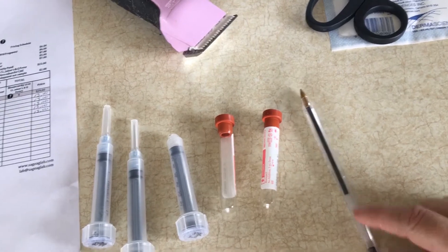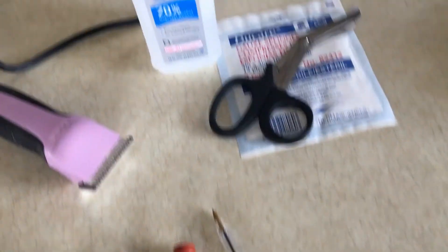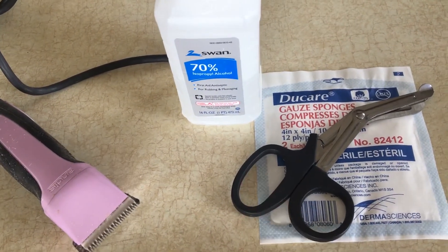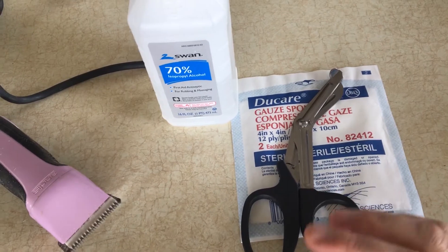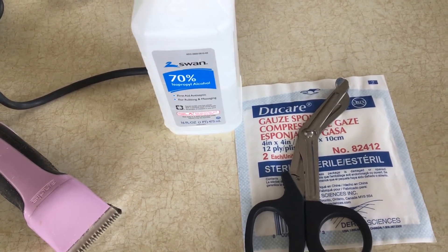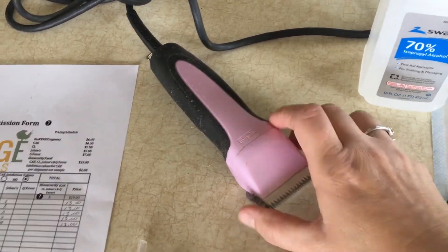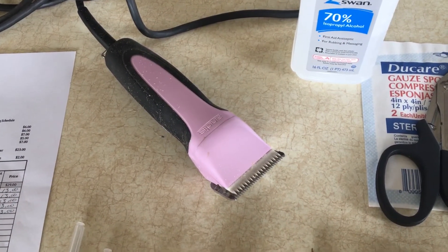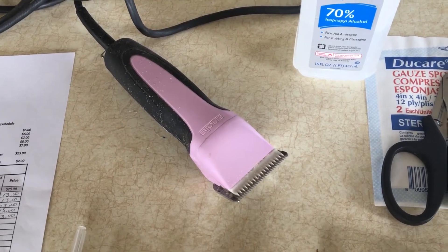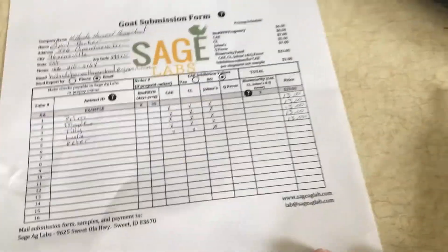I get the vials from my local vet. You need some sort of marker — I use a pen to put the animal's name or identification on the vial. I do like to use rubbing alcohol to clean the area beforehand. You can apply it with gauze. You should disinfect the area as best as possible — it also helps wet the hair down so you can see the vein more clearly. I use trimmers to clip the neck area where I'm going to be drawing, making a big wide sweep so I can see everything clearly.